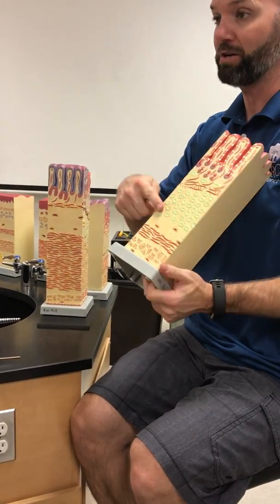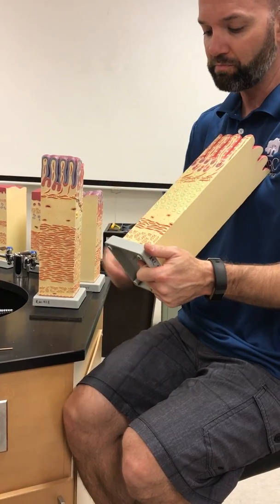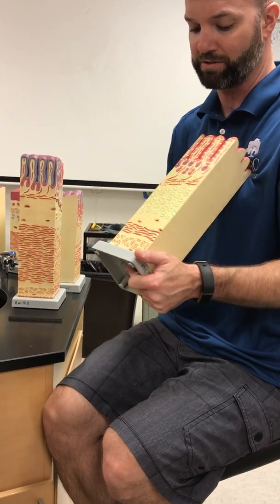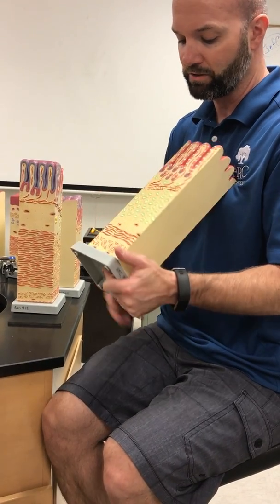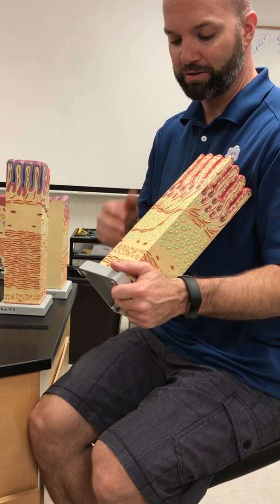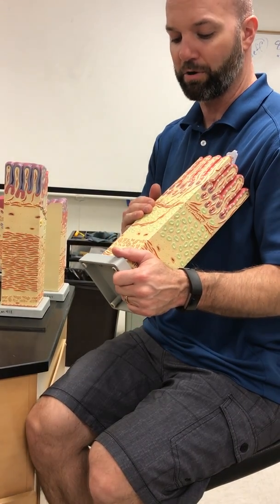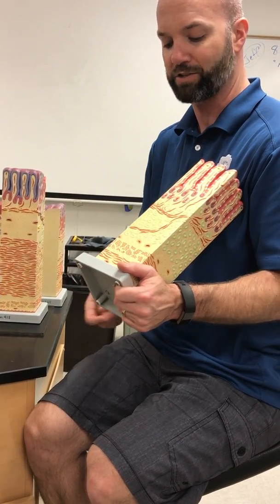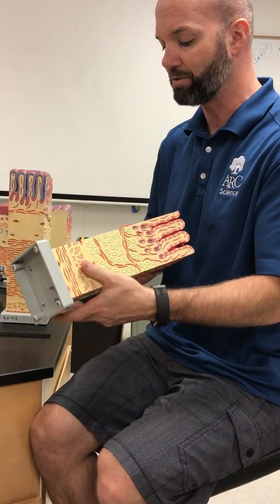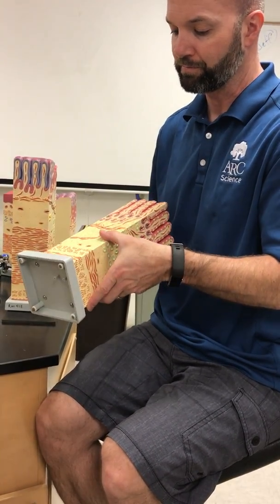And then this tells us duodenal as well. So adventitia and these submucosal glands. Okay, so those are duodenal glands. So for the most part, the submucosal glands are duodenal, and the mucosal glands are intestinal glands or intestinal crypts.